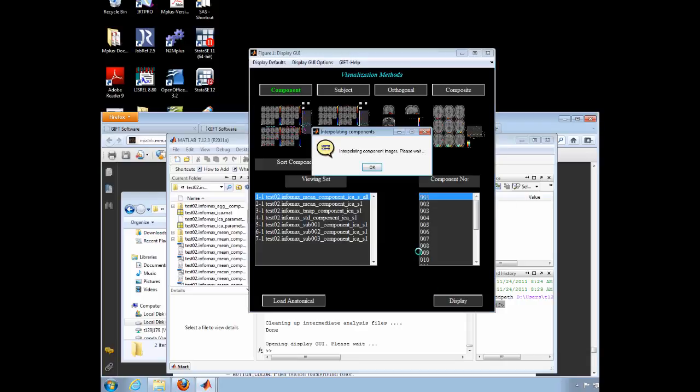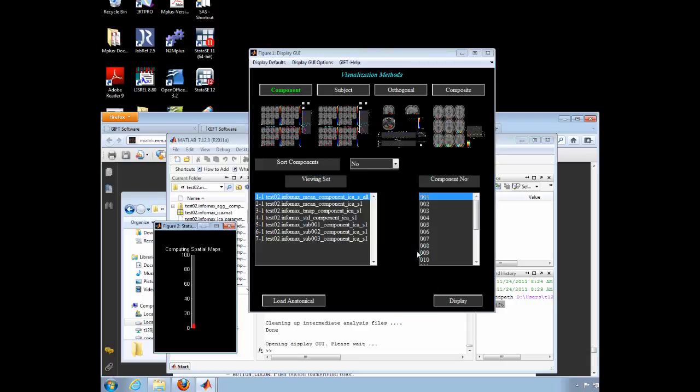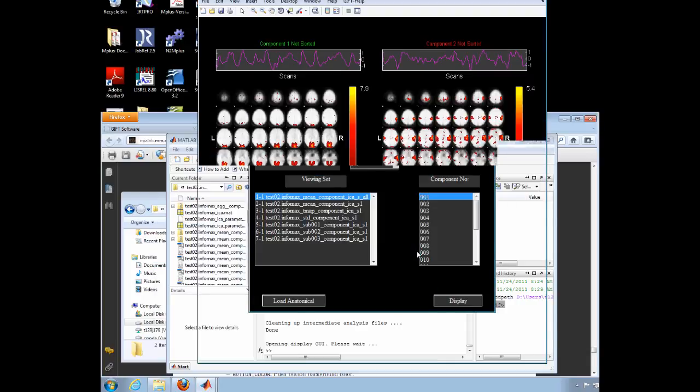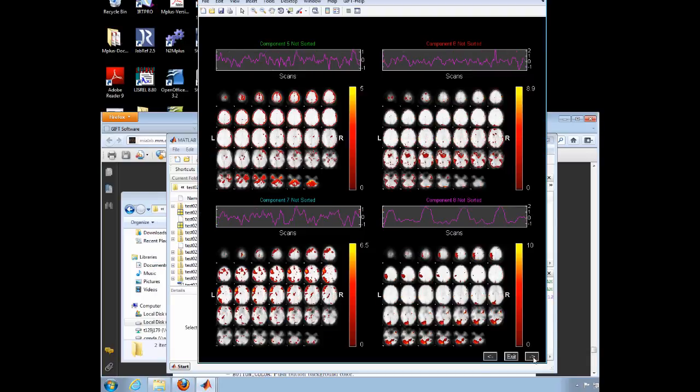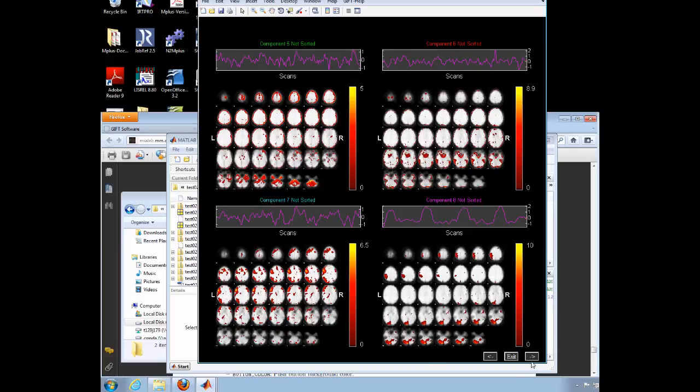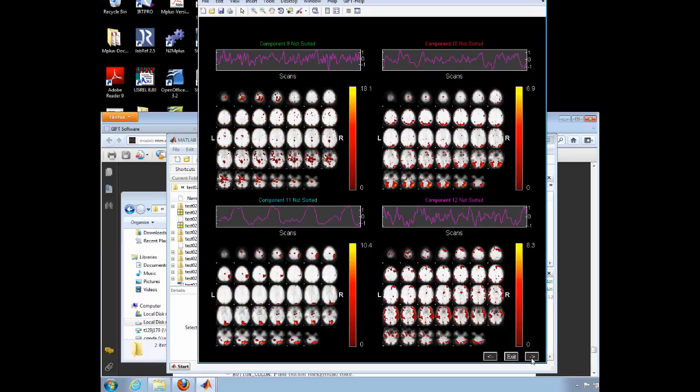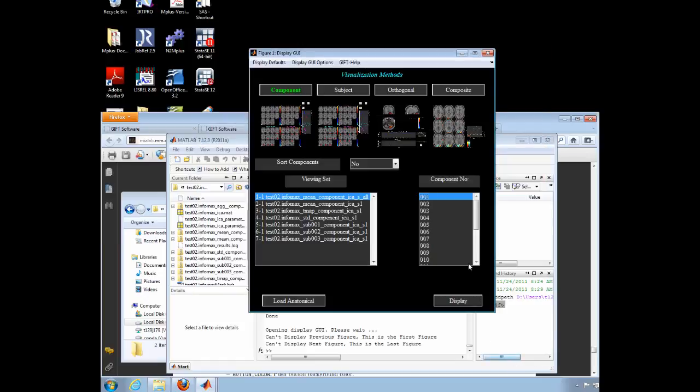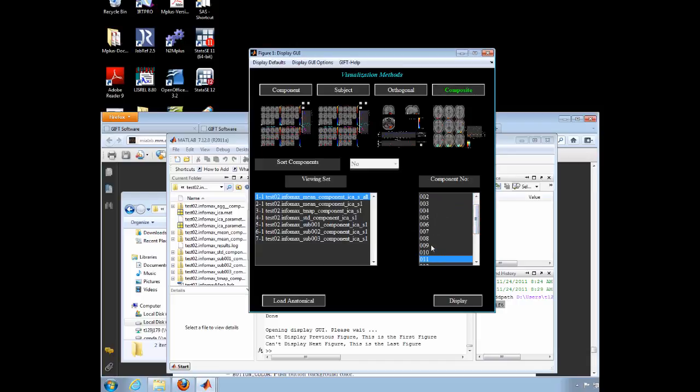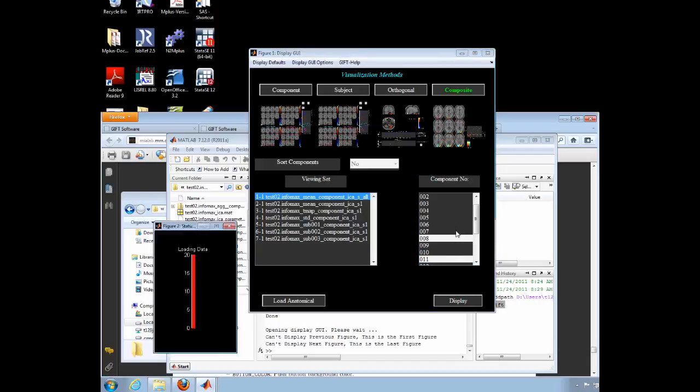You will notice that the results are not identical, but the components 8 and 11 are similar to the prior components 1 and 6. If your results are robust, you should see the same patterns appear using multiple algorithms.